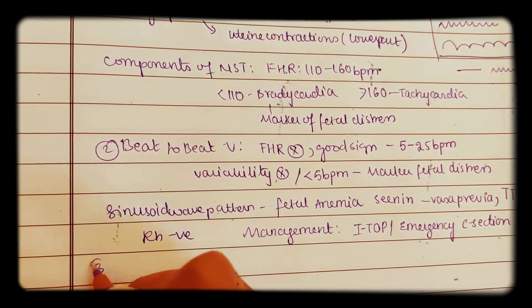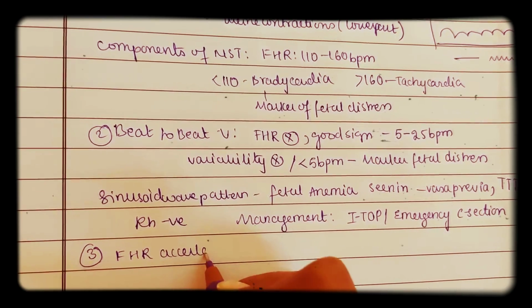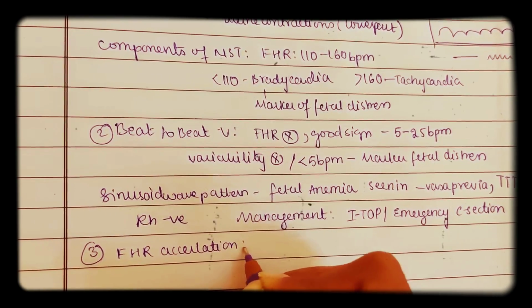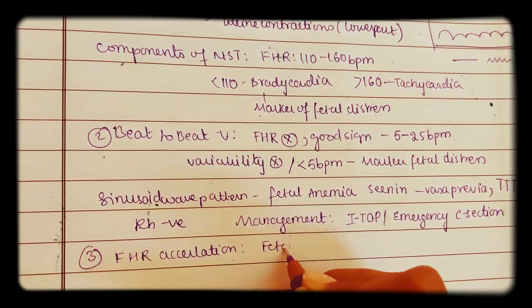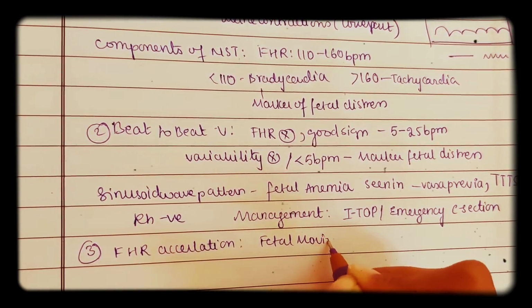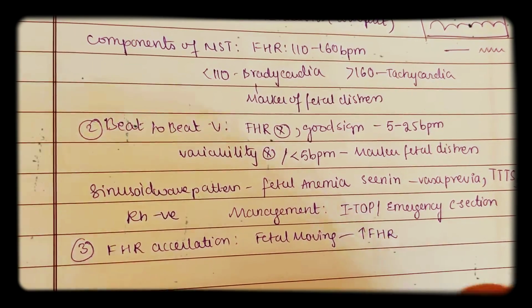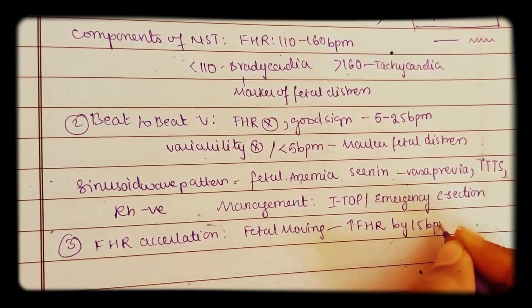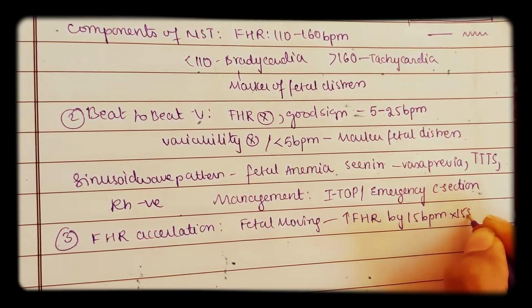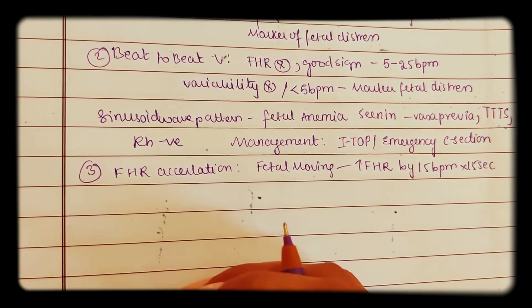Now coming to another test which you do, which is fetal heart rate acceleration. So what is this acceleration? When the fetal movement occurs, when the fetus is moving, there is an increase in fetal heart rate by 15 beats per minute for 15 seconds. So actually it should increase. This is also a good sign. Okay, then it denotes a healthy fetus.